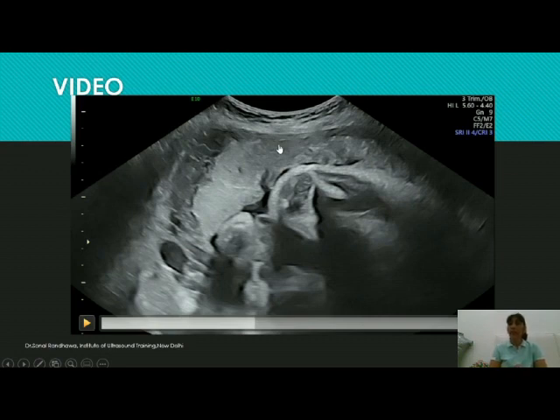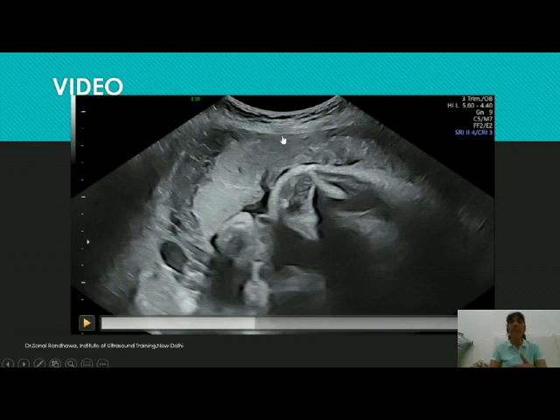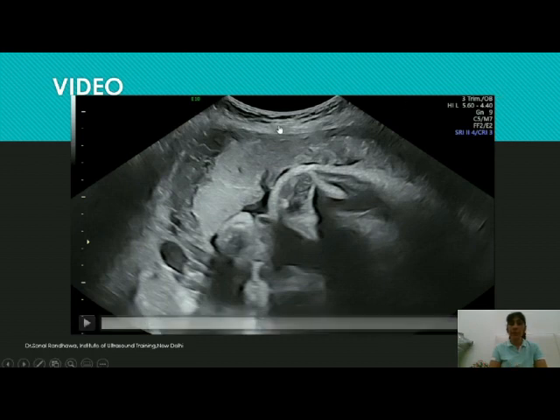In this next area, the dark retroplacental space is totally gone and you can see the serosa and the placenta directly. Here is an important precaution: whenever you are scanning a thin patient, do not put too much pressure with the probe. If you press too hard, this spongy area will get compressed and you will have a false appearance of placenta creta. Keep the probe pressure light.